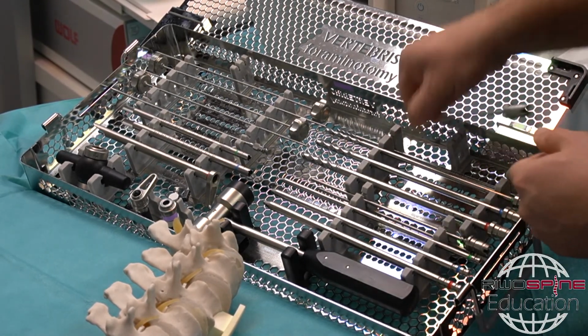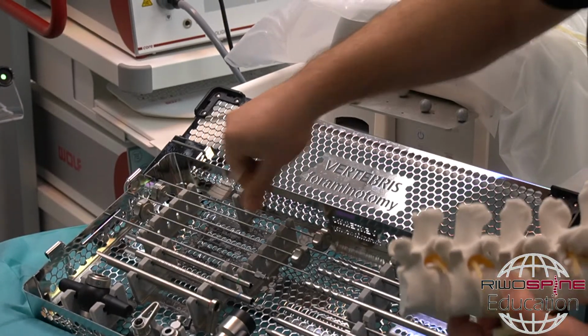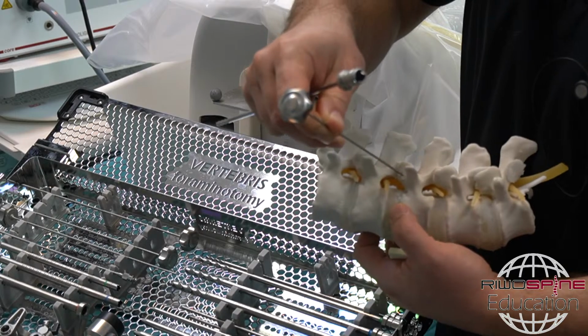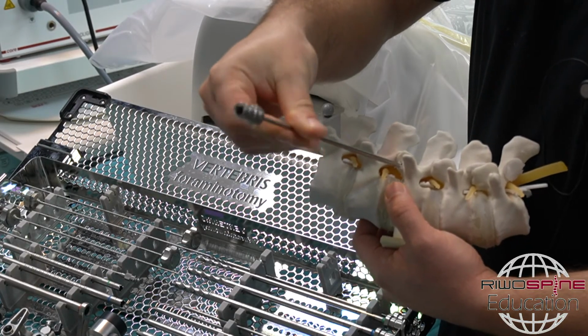There are two possibilities. First of all, if you want to dock on the bone, you can come with the needle or with the Jamshidi needle. You can dock on the facet joint or the bone, then guide wire, and then you can start with the front cutting burrs like that.